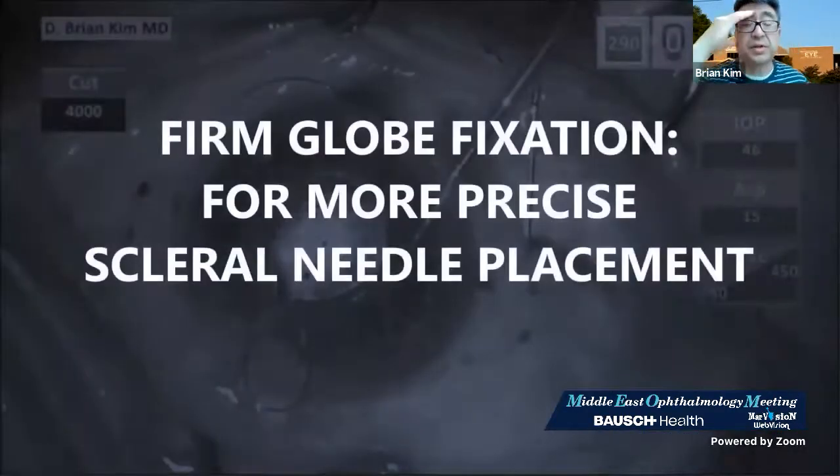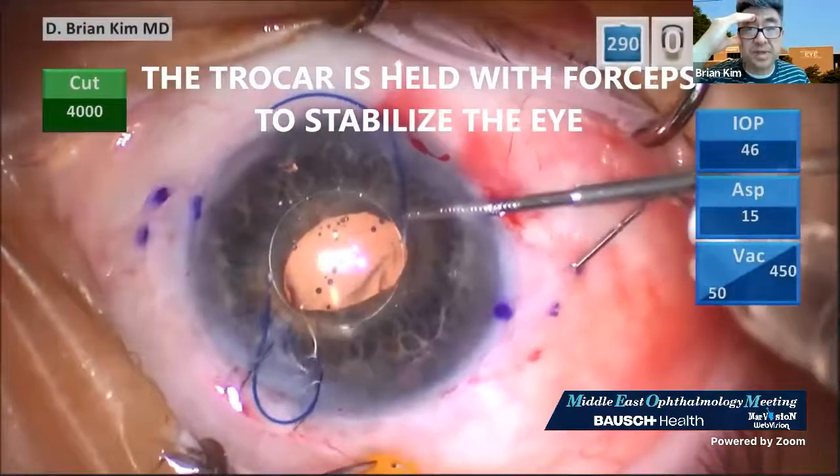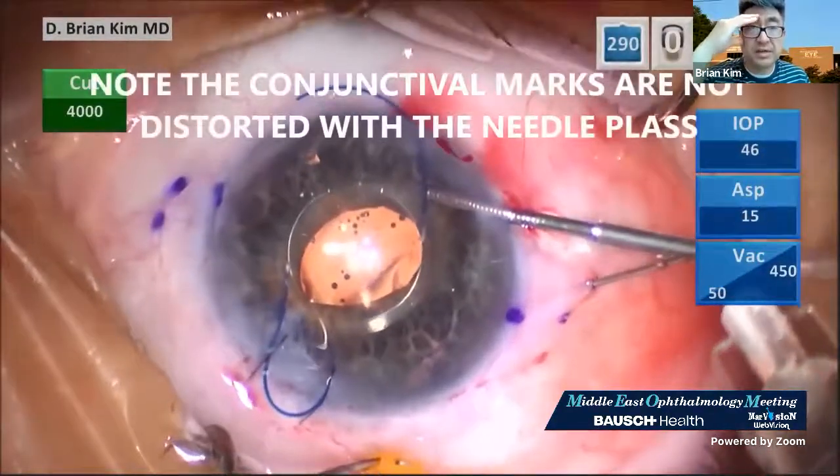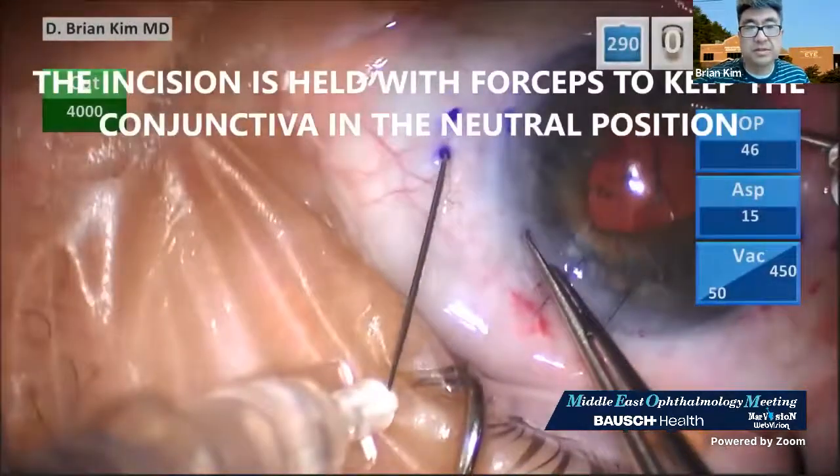This is just a video illustrating my point. The trocar is held with forceps to stabilize the eye, and you can see that the conjunctival marks are not being distorted with the needle pass.